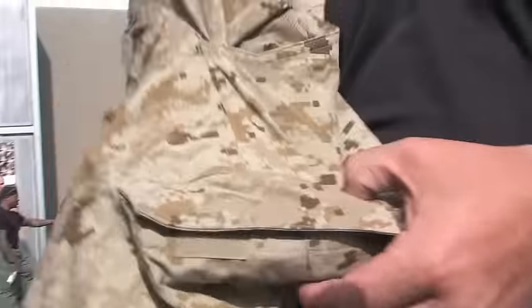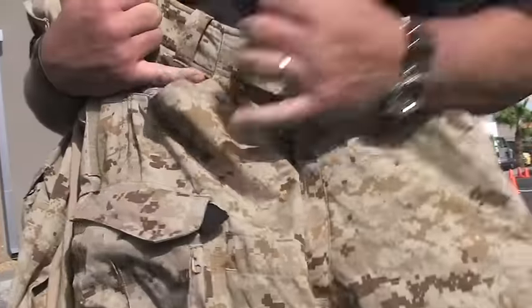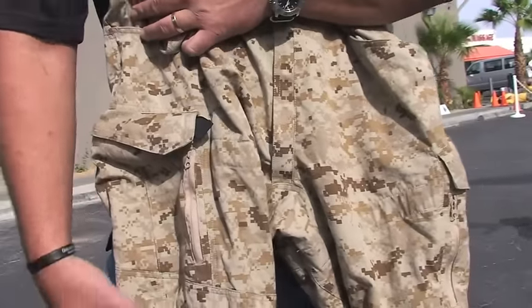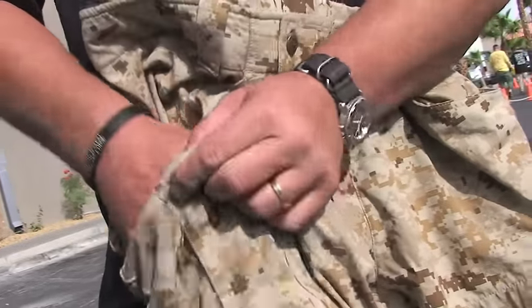One of the key aspects of this uniform is an integrated tourniquet system that is integrated into the uniform itself. It's built into the pants and the top at four different locations, with proximal and distal placement on the upper thigh, and it's accessible through the pocket that you already have on there.